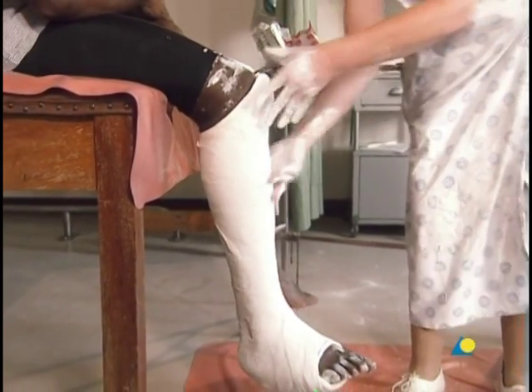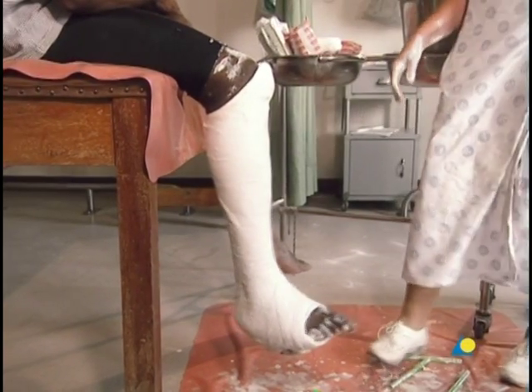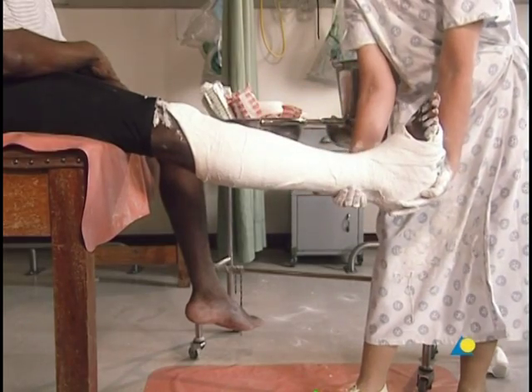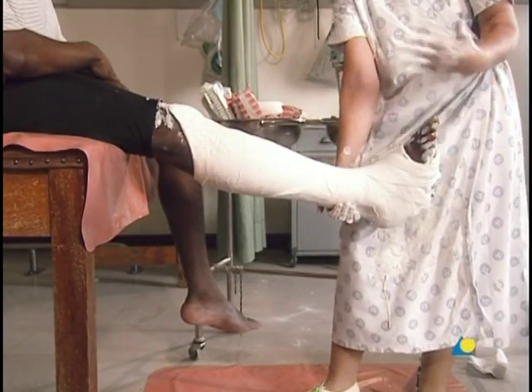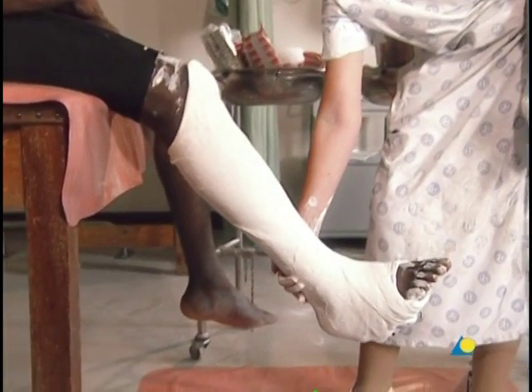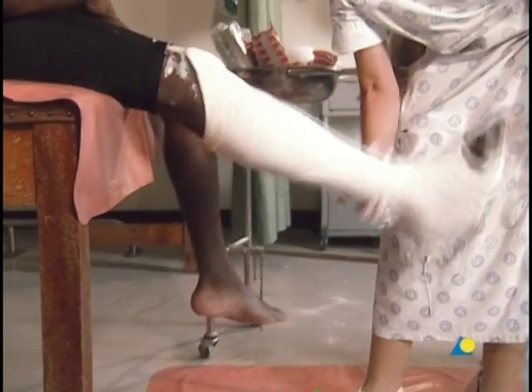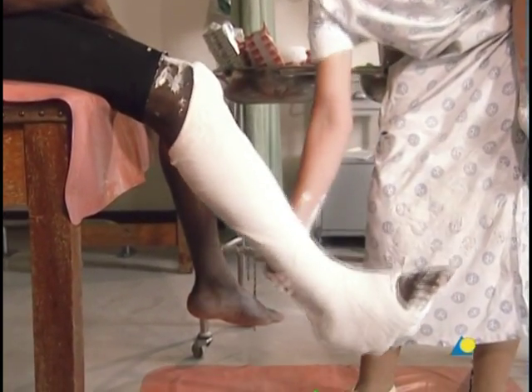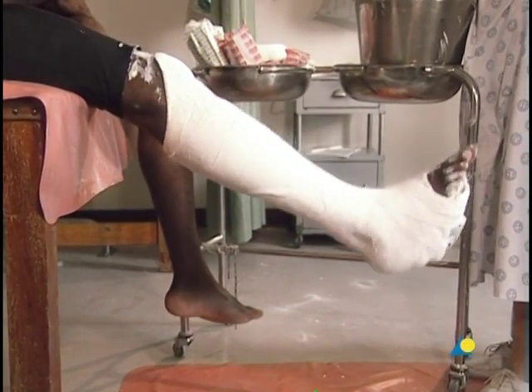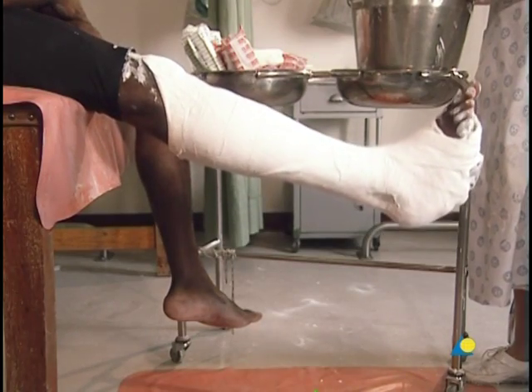As the PTB functions as a weight bearing cast, the patient should be instructed to wait 36 hours before beginning to walk, to allow the plaster to set. The exercise for the patient can now be explained and demonstrated: the patient sits with the leg extended, lowers the leg to the point of soreness, holds the leg there for five seconds, and then extends the leg. The exercise should be repeated as necessary to relieve any soreness of the knee. The application of the PTB, or patella tendon bearing cast, is now complete.